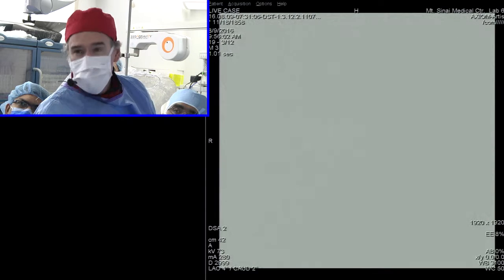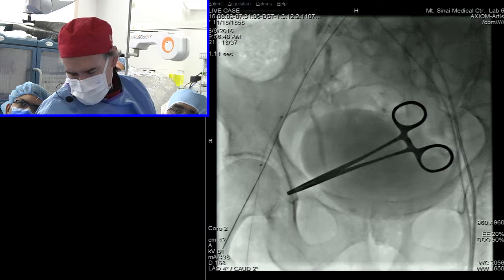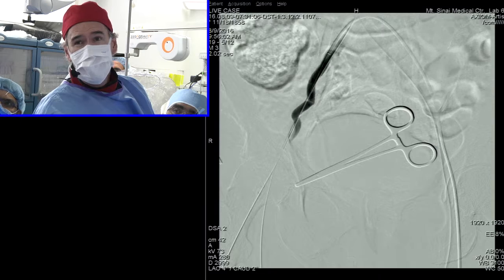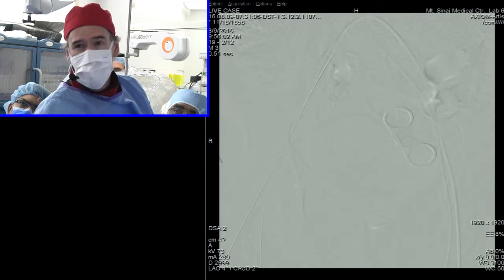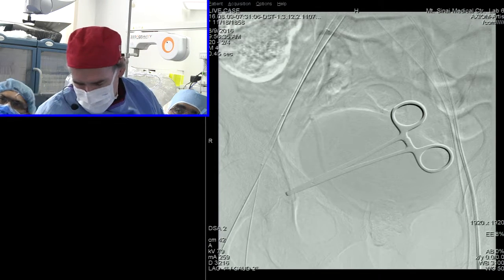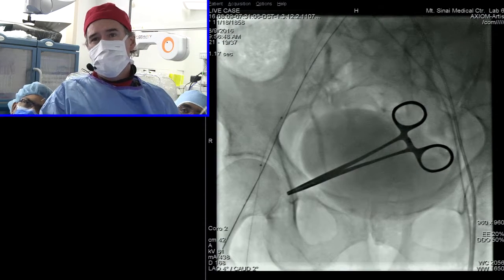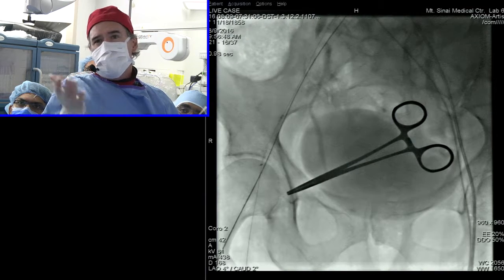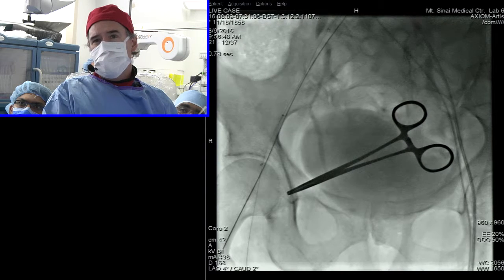There's a little bit of leakage out the wire tract that's getting externalized. So we then took a 7040 balloon, and there's a great teaching point I wanted to show you here. Before the case we had that 018 wire down the right leg, and when we went to advance the balloon to tamponade this, it was quite obvious that the 018 wire was hooked up under the pre-closed sutures. When we started doing this, I used to fear this quite a lot. You can see us trying to gently advance the balloon. It's not going; it's stuck at the pre-closed suture level.